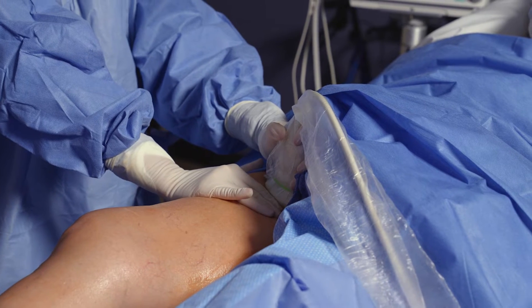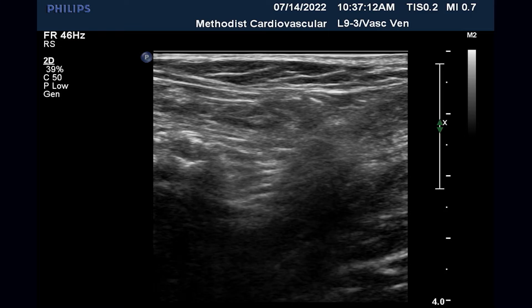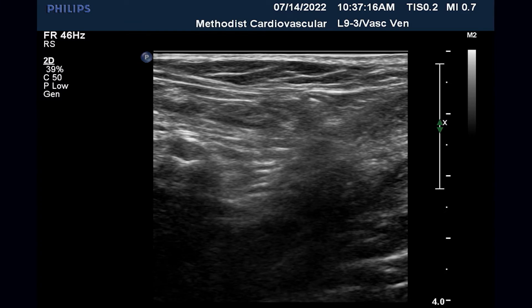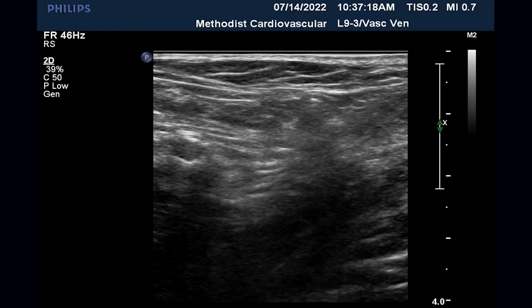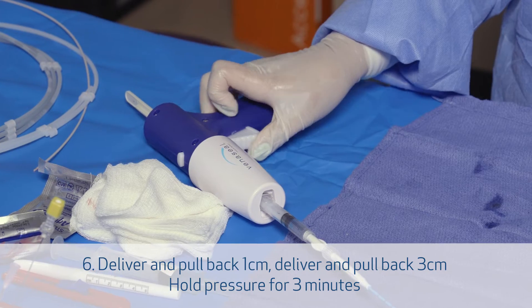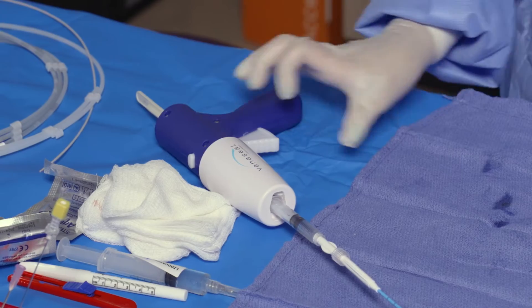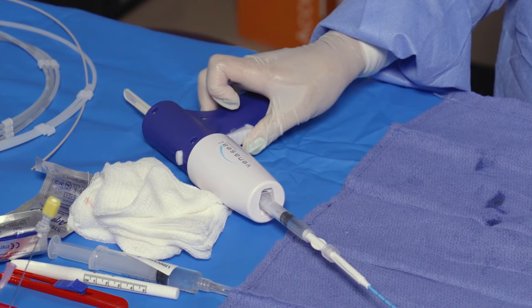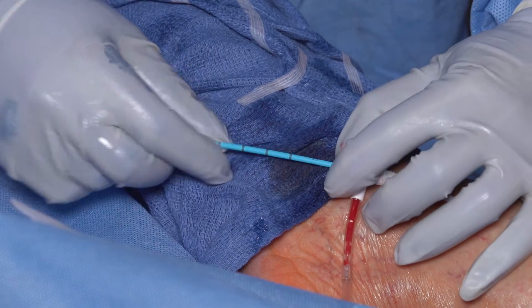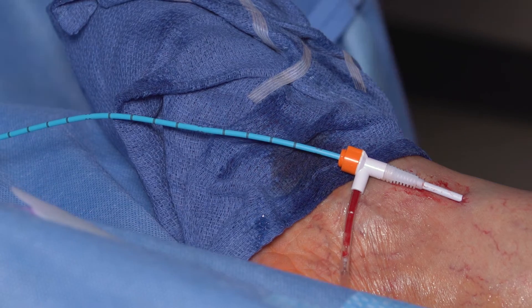Either you or your assistant should place light pressure with the transducer probe distal to the saphenofemoral junction so that no glue extends beyond that into the deep system. Now we depress the trigger for 3 seconds, bring back the glue catheter 1 centimeter, press it again for 3 seconds, and move back the catheter by 3 centimeters. Now we hold for 3 minutes — this is often the hardest part of the case.